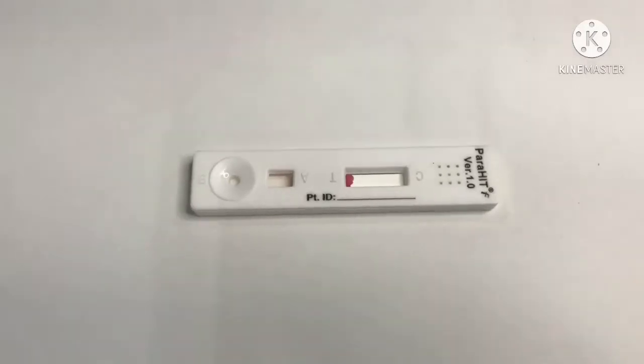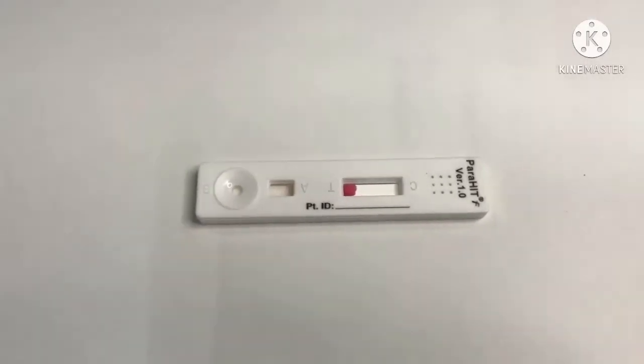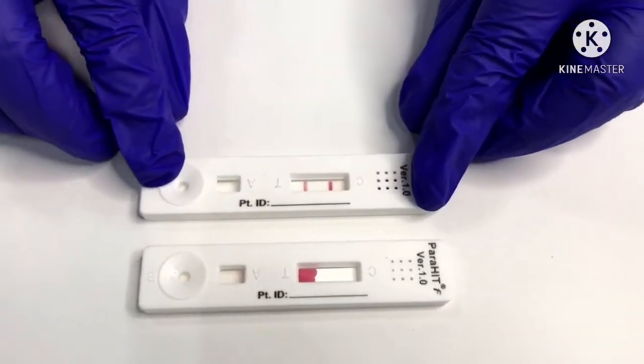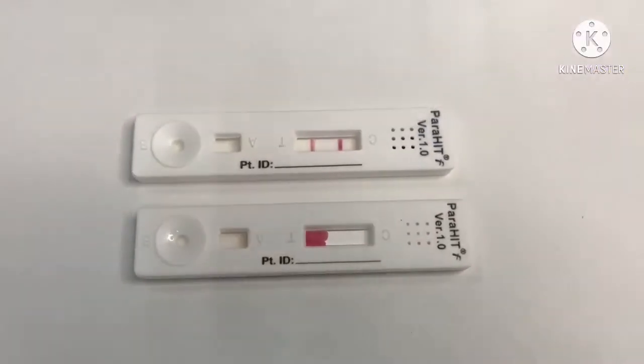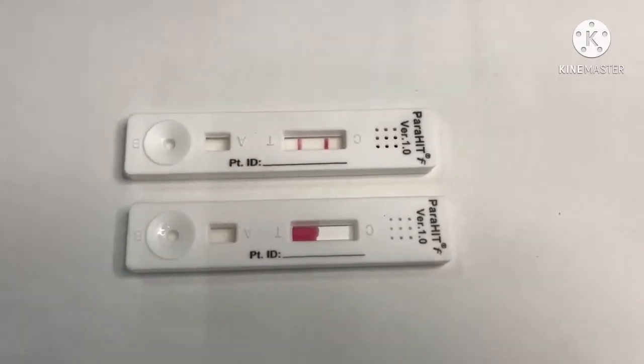Read the results after 20 minutes. Once the test is completed, we can observe the test band and control band.